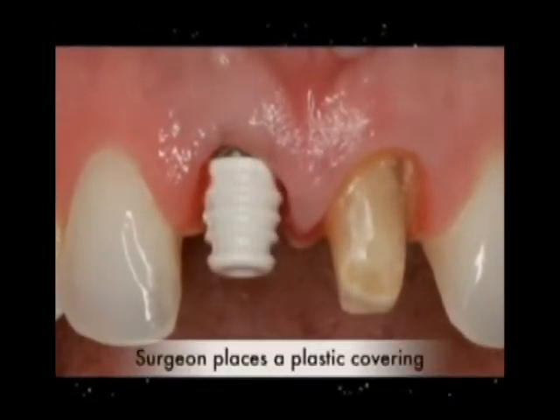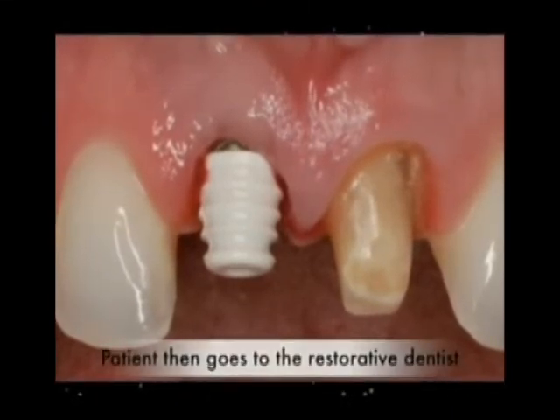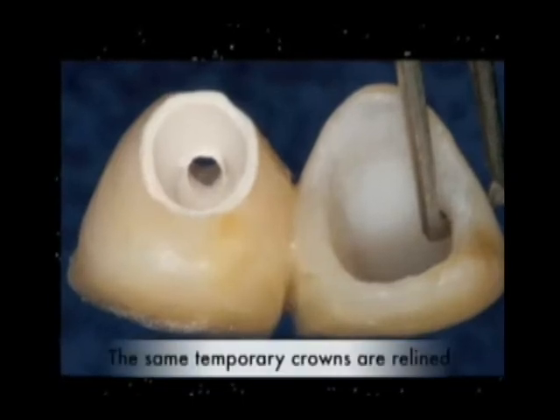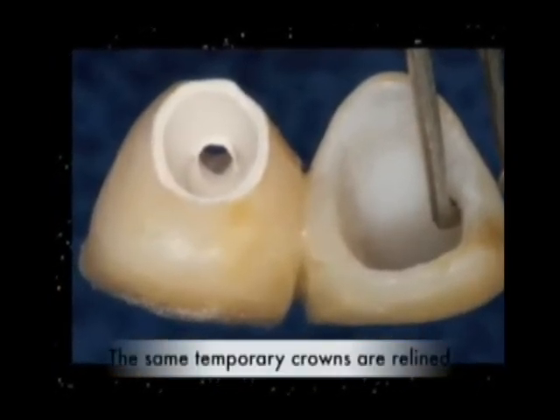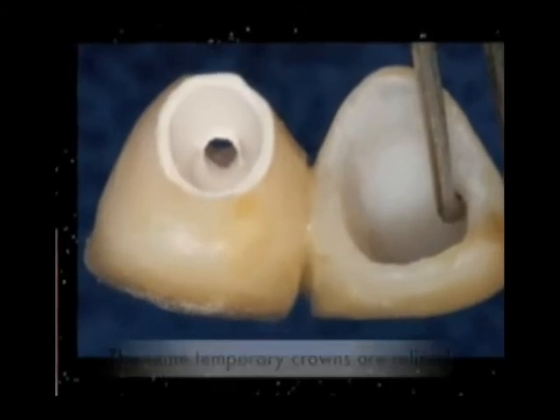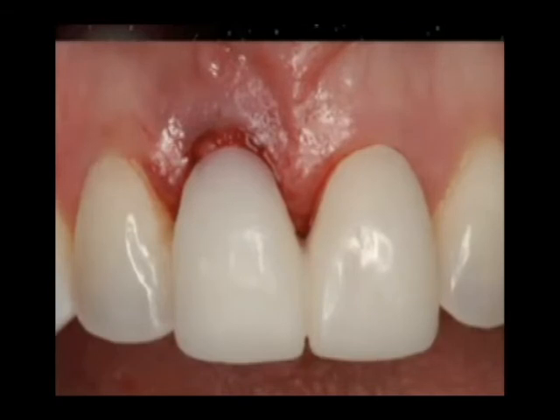This temporary abutment is simply screwed on the implant and again houses a plastic coping that then the surgeon can transfer the patient to the restorative dentist, and the restorative dentist simply can reline that previous provisional to fit on the implant and plastic cap. And so this patient has an immediate restored implant the day of implant placement.